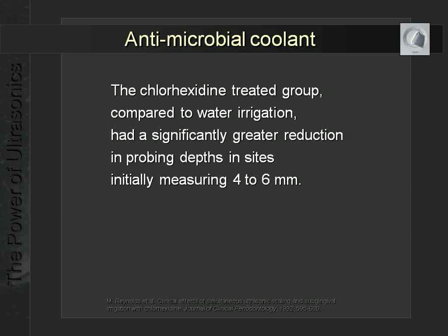But if you use chlorhexidine in your unit, then the piping which is in your unit will get clogged by the sticky ultrasonic substance. So you need to rinse it very thoroughly after each chlorhexidine treatment, and maybe rinse it with a vinegar solution at the end of the week as well in order to clean them up. I started off by treating all my patients with chlorhexidine, and then after 6 months, all my units were in repair.